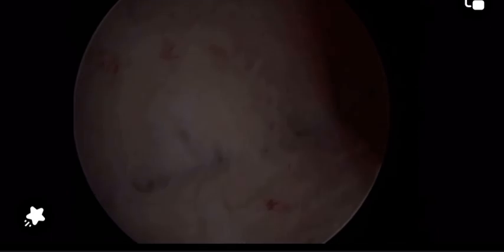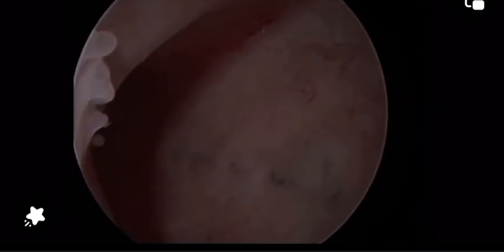There is no need for concomitant laparoscopy. It wouldn't help at all. It depends on your visual judgment on the fundus and equal level of both tubal ostia. Every now and then, pull back, enjoy your job. You can obviously appreciate how much surface area is added after release of the septum.